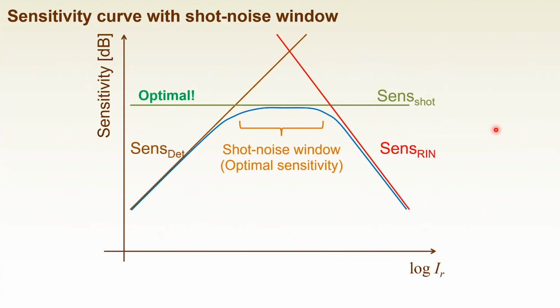And then I think maybe it's only two points. Now I think you can understand the sensitivity curve. Also in the textbook I show this curve, right? So here is one of the typical OCT sensitivity curves.